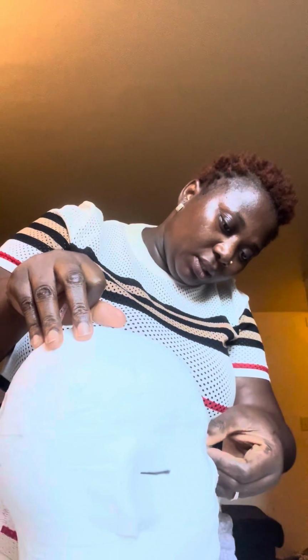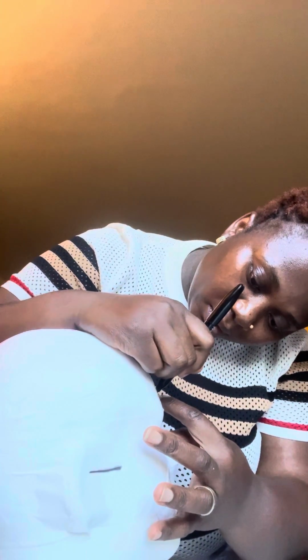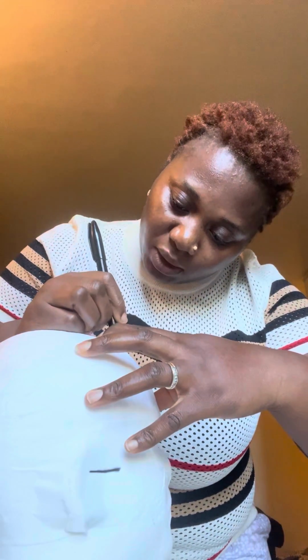So I'll take my tape to measure from nasion to inion and see what we got. 33. We got 33. So 10% from nasion to FPZ is 3.3. Then you take 20% from FPZ to FZ, which will be 6.6.